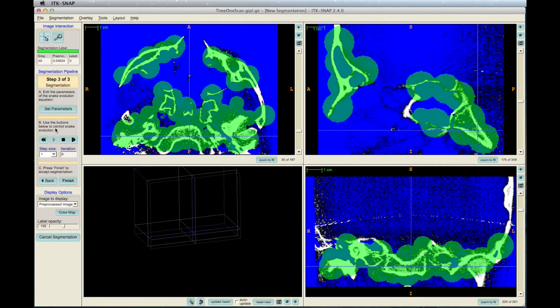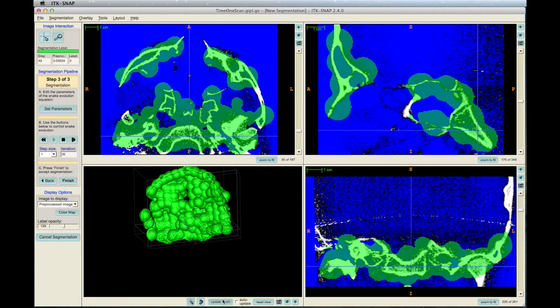Click Accept in the window and then the Play button in the left toolbar. You can stop it at any time to see how the segmentation is doing by clicking the Update Mesh icon at the bottom of the ITK-SNAP window.